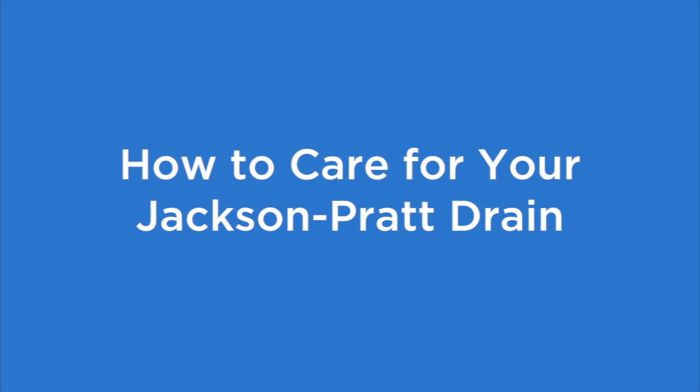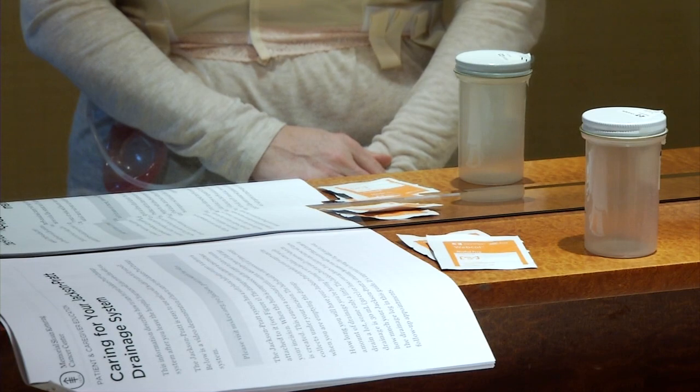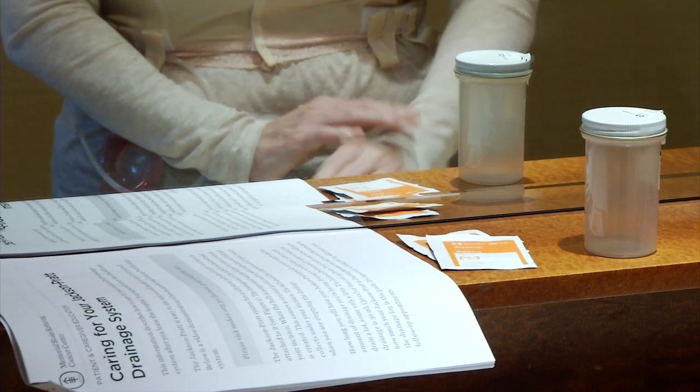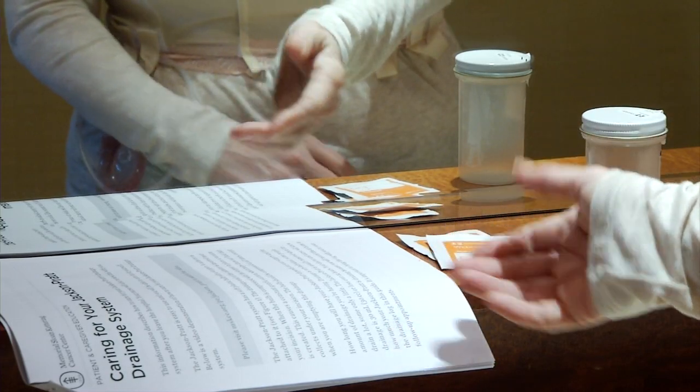This video will show you how to milk the tubing of your Jackson Pratt drain, empty the drainage bulb, and record the drainage. You'll want to make sure you have all the supplies you need in front of you. You'll need a measuring container, an alcohol pad, and your Jackson Pratt drainage record.